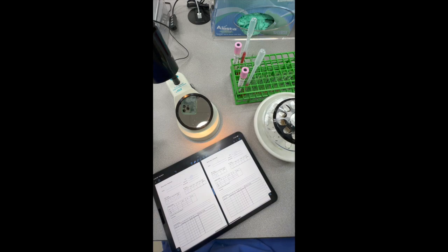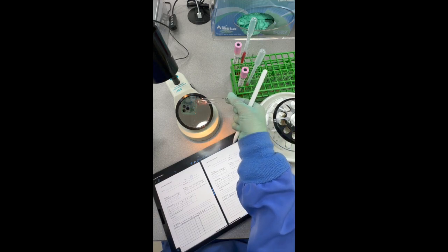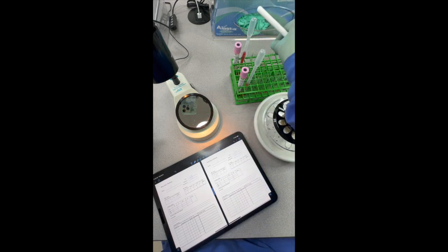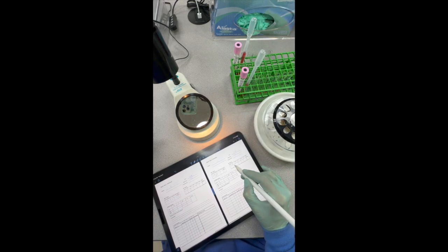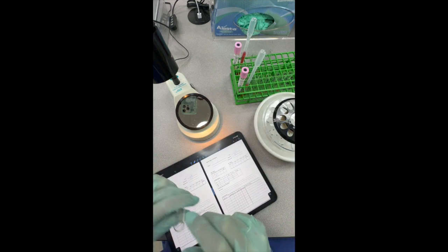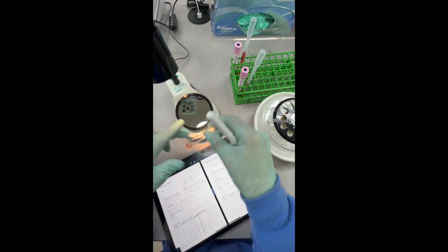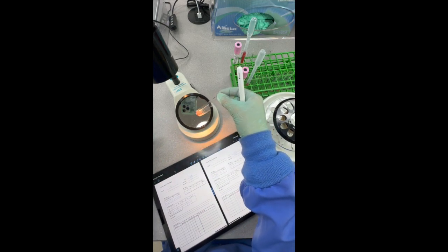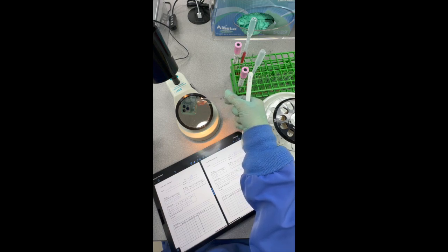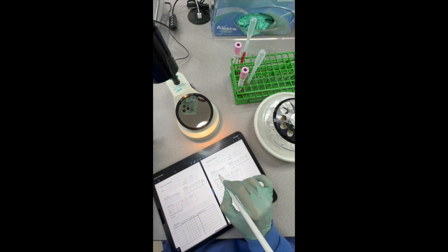Negative in there. And here's our control, D control or RH control. Nice negative reaction. Our back type. So we had a 4+ reaction for A. We're going to look at our A cells. Since the patient has A antigen on their cells, we're going to expect no reaction. Okay, they should not have an antibody against the A cells. And very good. That looks good. That's negative. I'll put that in there.